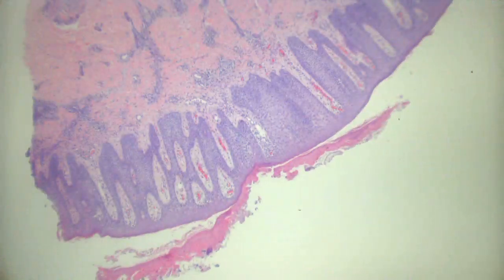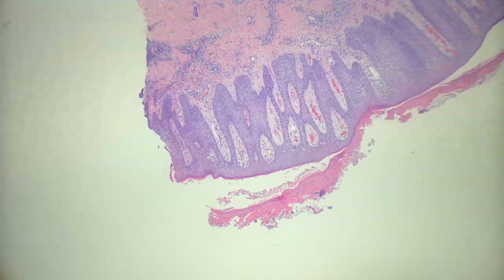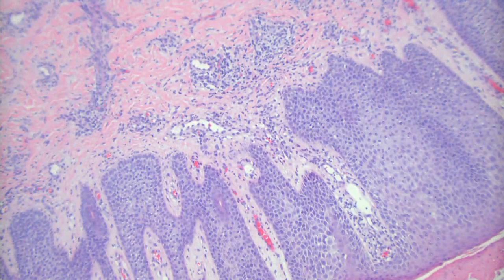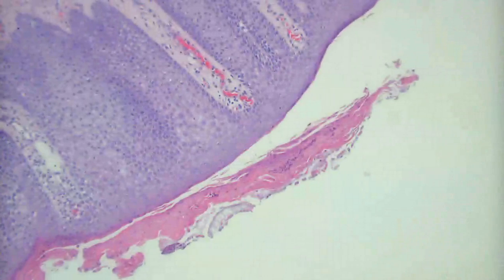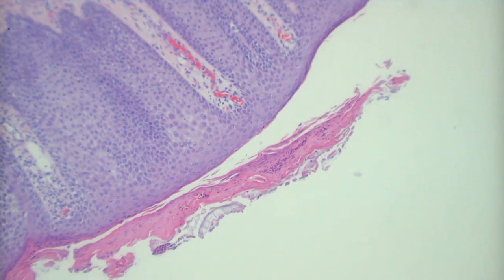It's the spongiosis. Yeah, there's quite a bit of spongiosis. It doesn't have the nice mounds of parakeratosis with neutrophils. It's got a pretty dense inflammatory infiltrate. So it's probably psoriasis for all the reasons you said, but it's probably psoriasis that's got some superimposed inflammatory change and spongiosis. So clinically, it probably didn't look like classic psoriasis, and that's why they biopsied it.